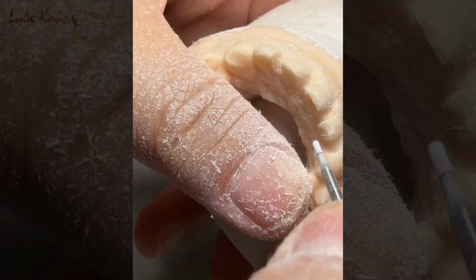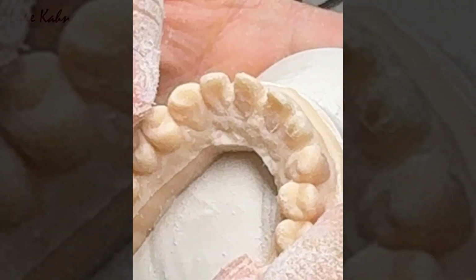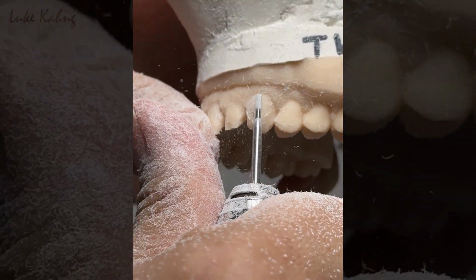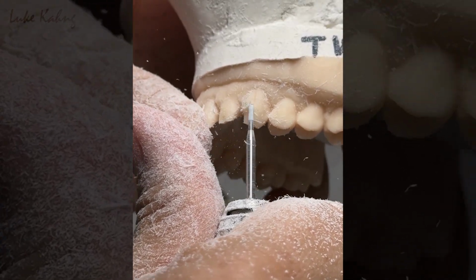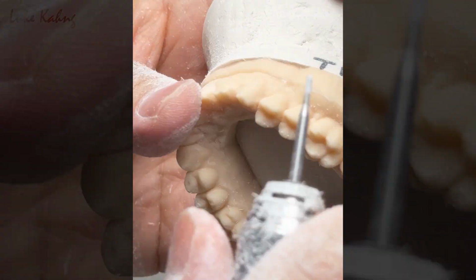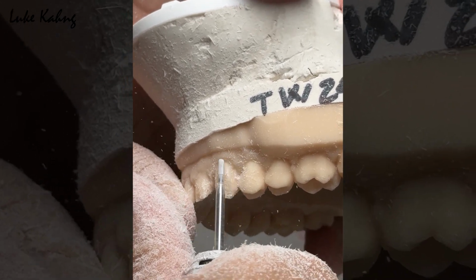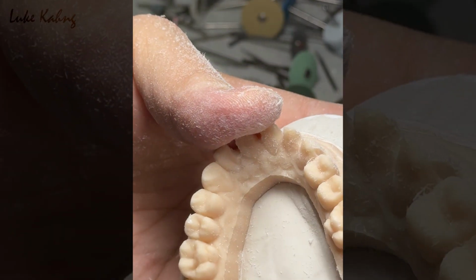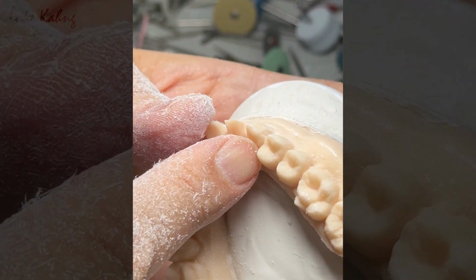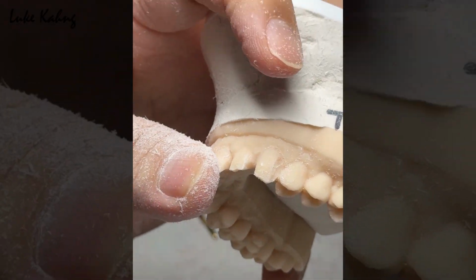So the margin line will be there. Okay. Alright, 2. Here's the veneers, this is bad. Same thing. Deeper. You don't have to break here because it's natural. It's very nice in gradual form, so I don't need to open that area. Just make it like this. That's okay.